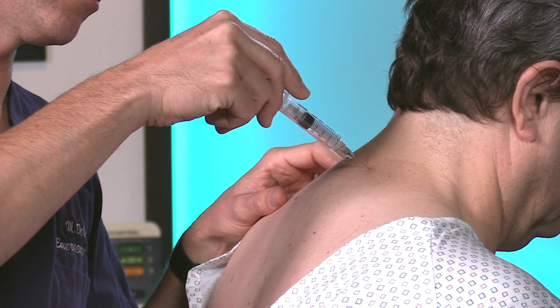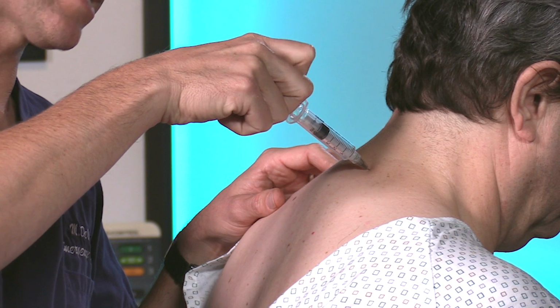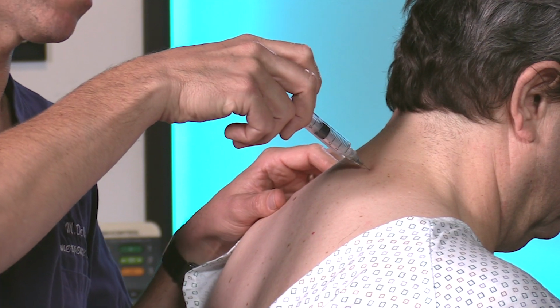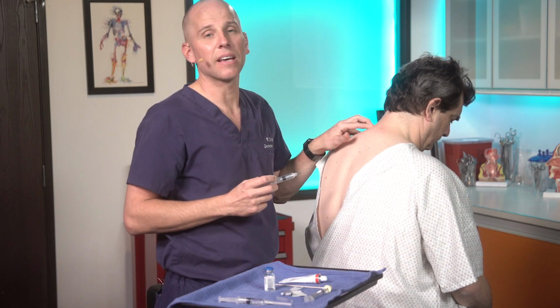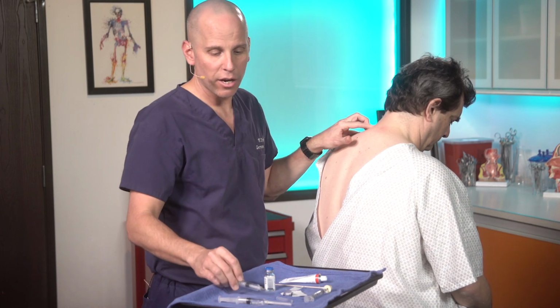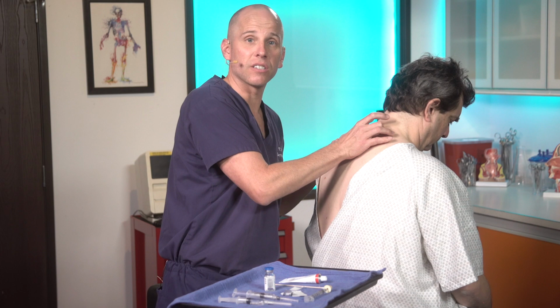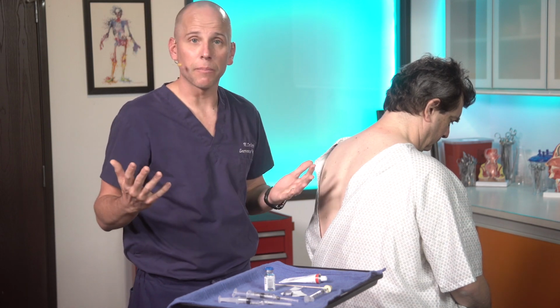So I'll take that needle and just about almost hub it, about 1 inch to 1 1/4 inches in, pull back to make sure I'm not in vasculature, and I'll put 2 to 3 cc's of anesthesia in that spot, pull out, rub it in, and then repeat the exact same thing on the other side. And now you have bilateral paracervical trigger point injections. Really nice for the tension headaches, real nice for the migraine headaches. I'll come back in about 10-15 minutes and ask the patient if they're feeling better. If they are, awesome, I'm going to send this patient home. If they're not, well, then again, we're going to move on to our alternatives.